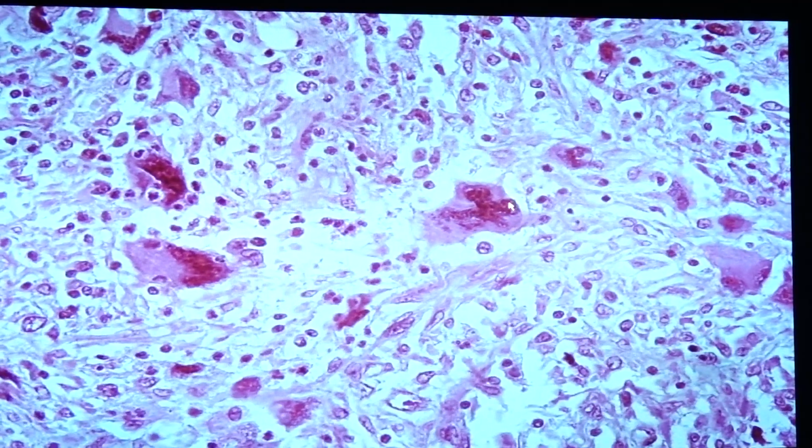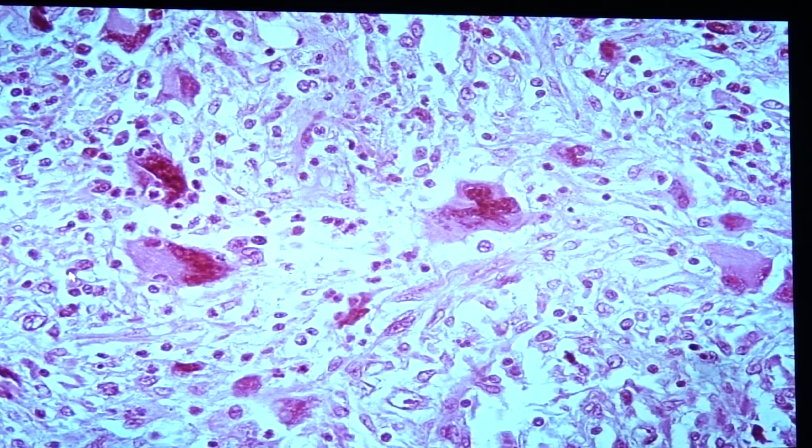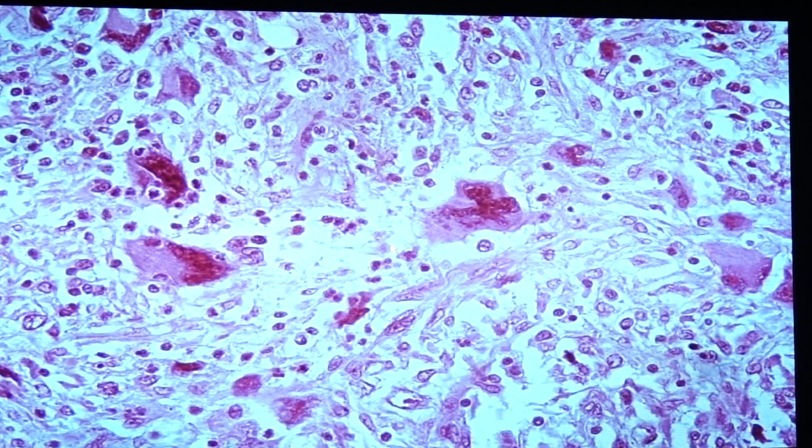These are the large cells, having bizarre nuclear figures and abundant eosinophilic cytoplasm. So these are atypical rhabdomyoblasts. In order to differentiate this one from the other spindle cells, because sometimes they would also have marked pleomorphism, we would test for myogenin, which would be positive.